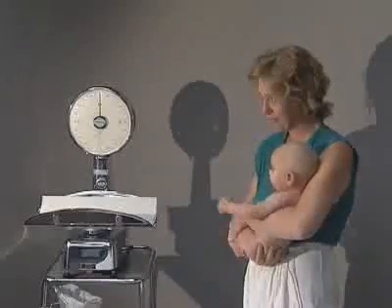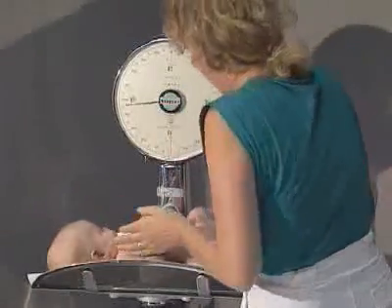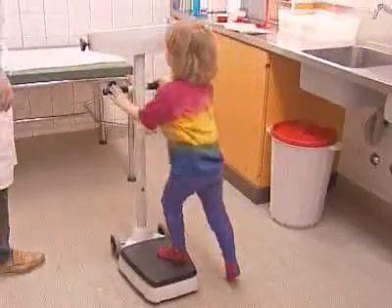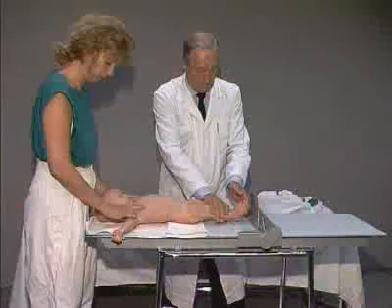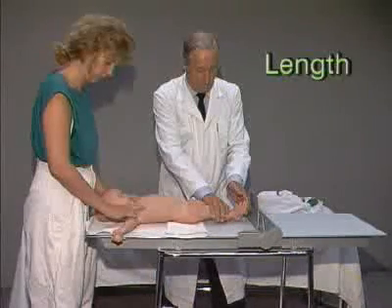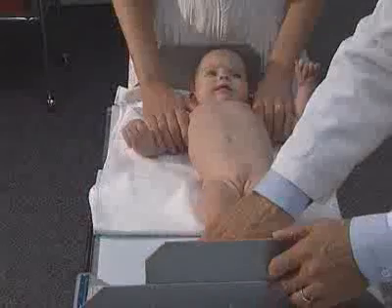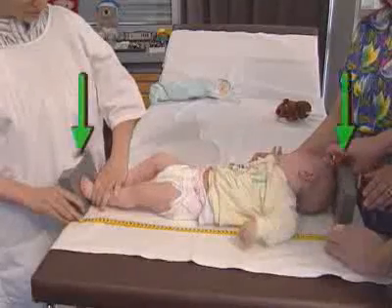Babies are weighed unclothed on a scale pan. The scale pan must be warm so as not to startle the baby. Older children are weighed standing on normal scales. The length of a baby or toddler is determined supine with a special measuring tool. In an emergency, 2 books will do.